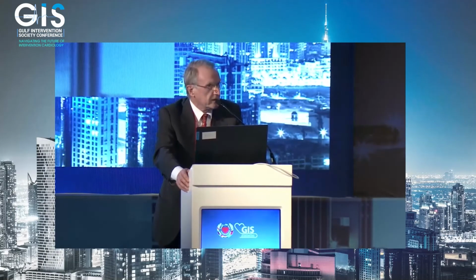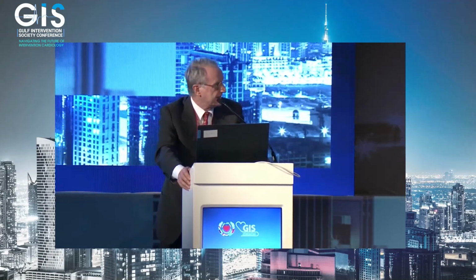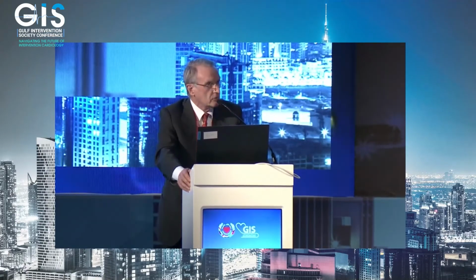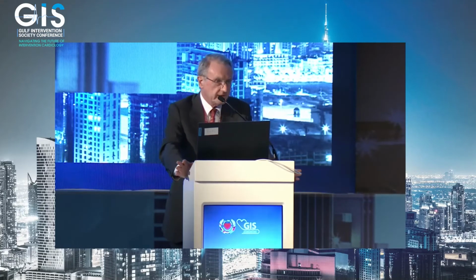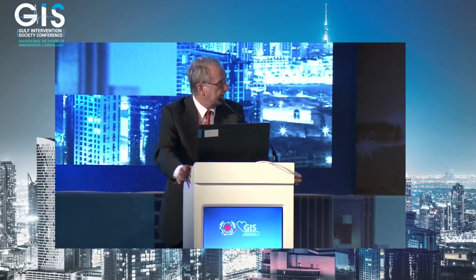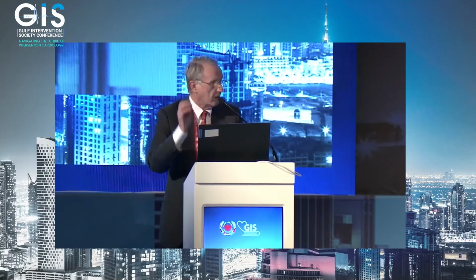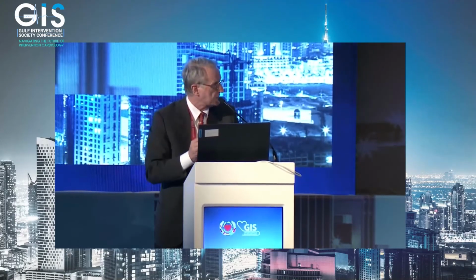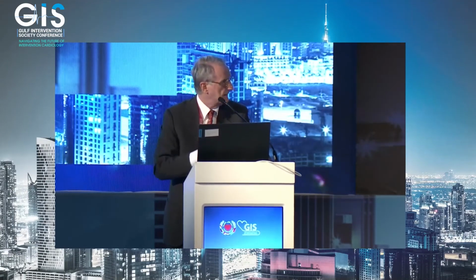We do not want to purposely create a dissection. If we get a good result without creating a dissection, we take it. But if we create a dissection, we evaluate if the dissection is benign or not. That's the difference. We don't purposely create a dissection, but not every dissection is considered a stented dissection.